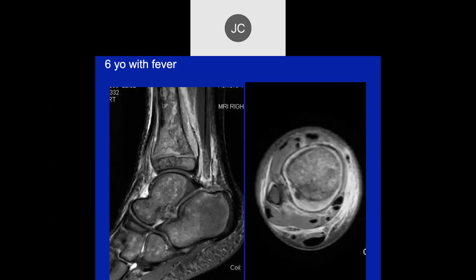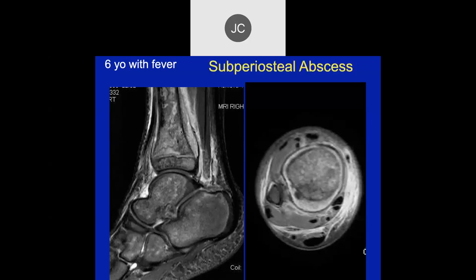A six-year-old with fever. Looking at the distal tibia, there's lifting of the periosteum with periosteal fluid and soft tissue edema. There's a serpiginous signal in the bone — it would be nice to have a T1-weighted image to compare. This is a subperiosteal abscess.